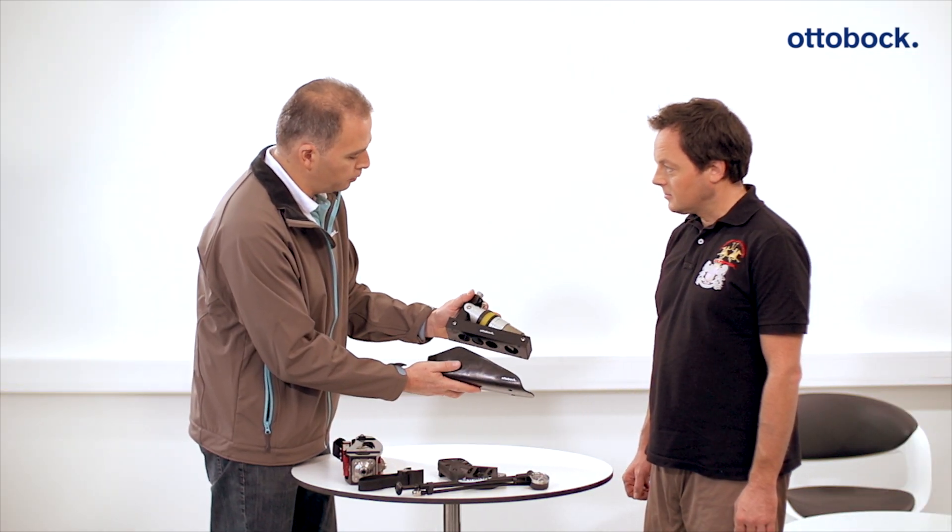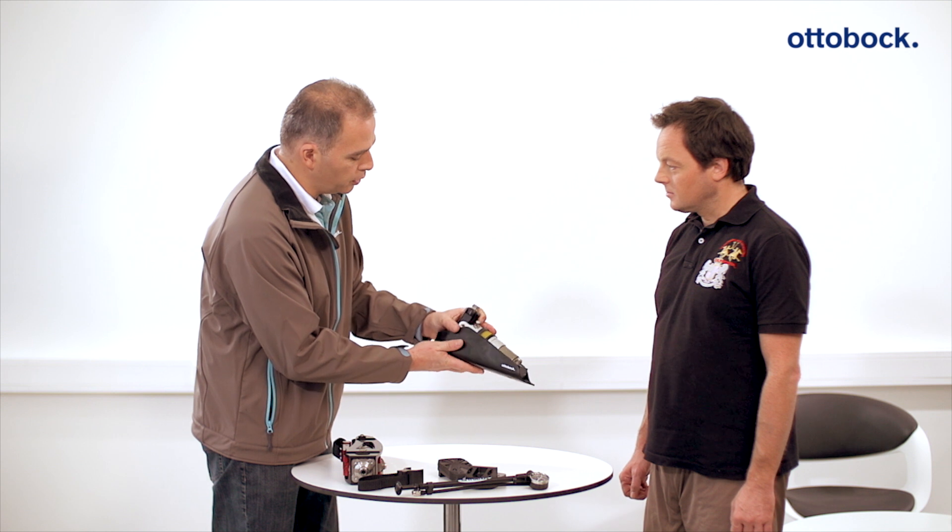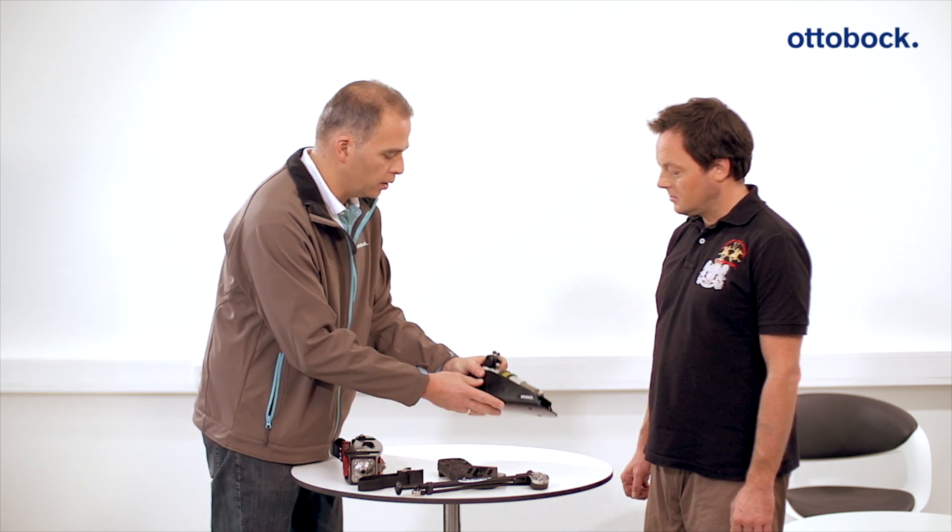For snowboarding, the prosthetic foot can be equipped with a foot shell with a fit particularly suited to a snowboarding soft boot.